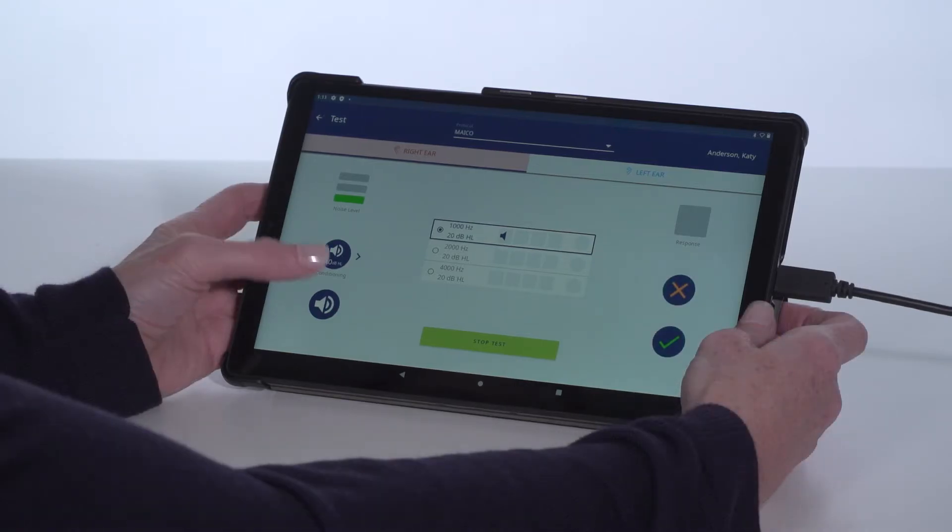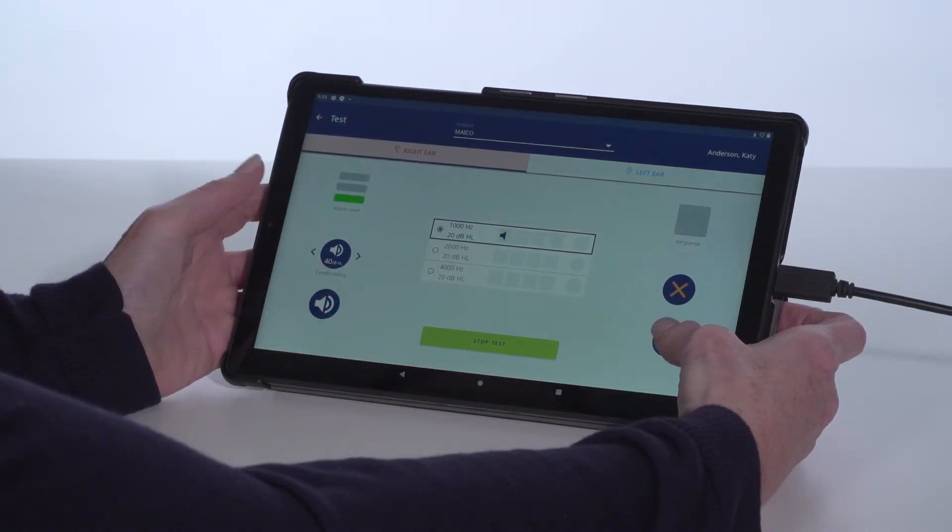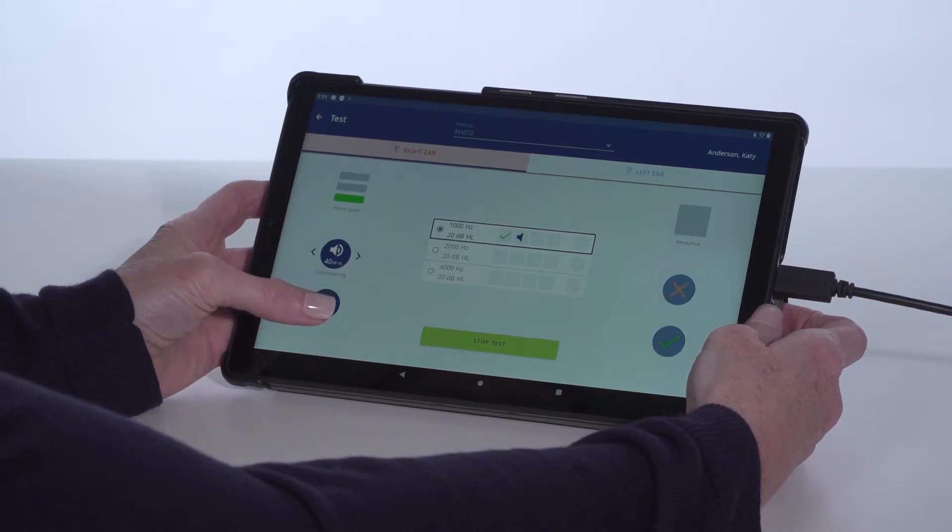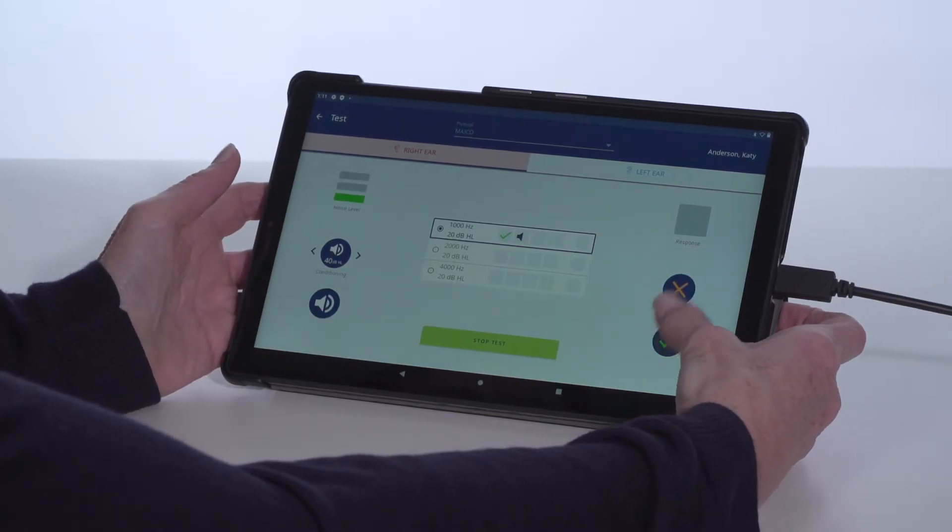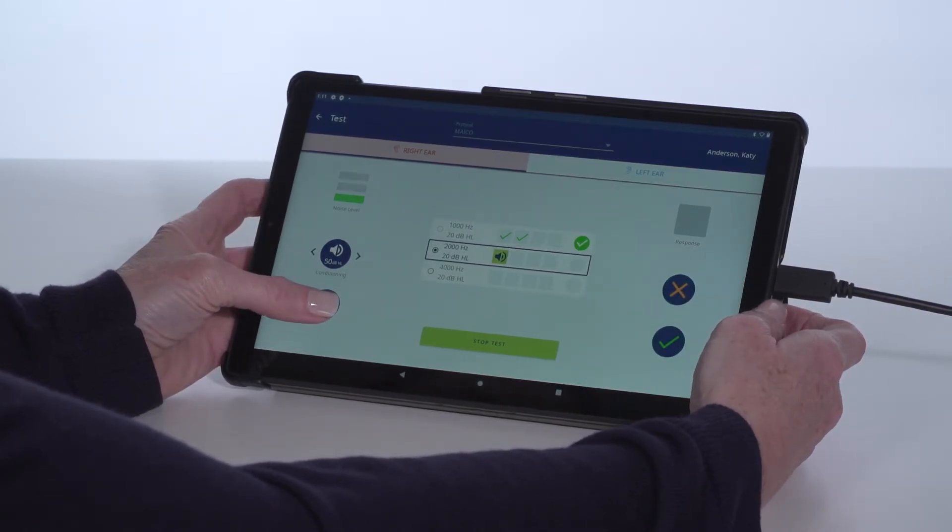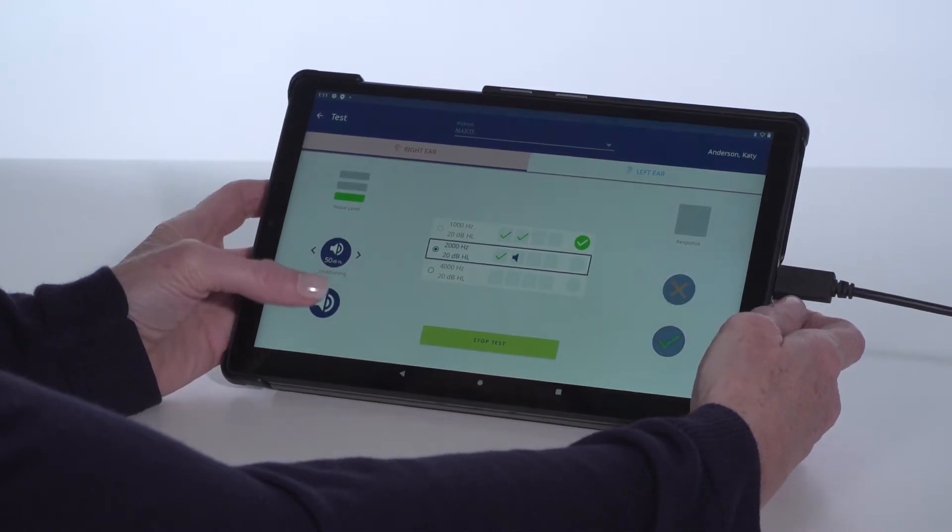When the subject is ready for the hearing screening level, touch the Present key and score the subject's response with the checkmark for Heard or an X for Didn't Hear. This is captured for each frequency.